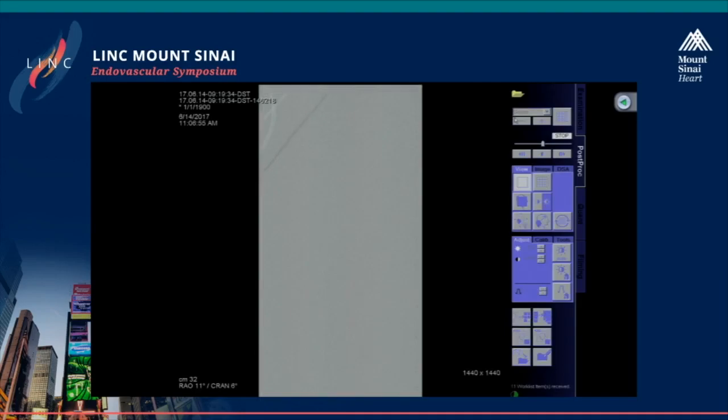You'll see that there's a little bit of plaque shift at that area, or thrombus. I am not sure that is the thrombus here. I have the marker of, it may be thrombus, but it's difficult to recognize for me.